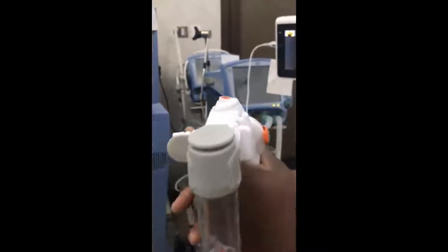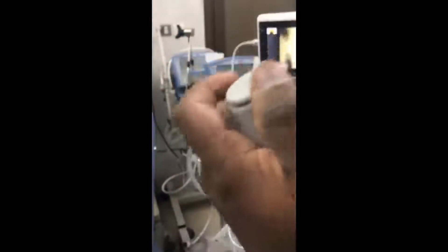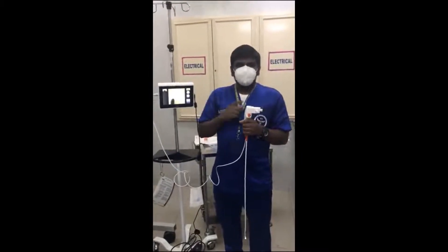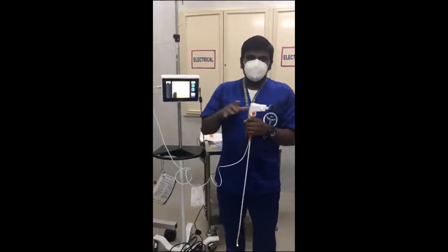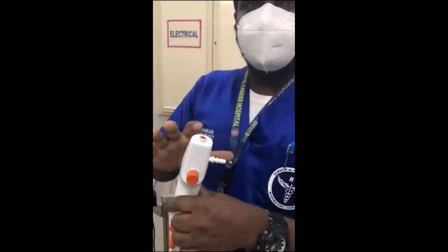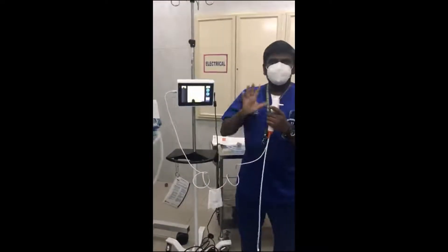Once the container is full, if you want to remove it, just remove and close it like this to send to the lab. Once you finish the procedure and the doctors want to remove the sample connections and do normal suctioning to clean the airway, just remove the sampler like this, close it, and send the sample to the lab. Then connect the suction connector here and do normal suctioning with saline to clean the lungs.